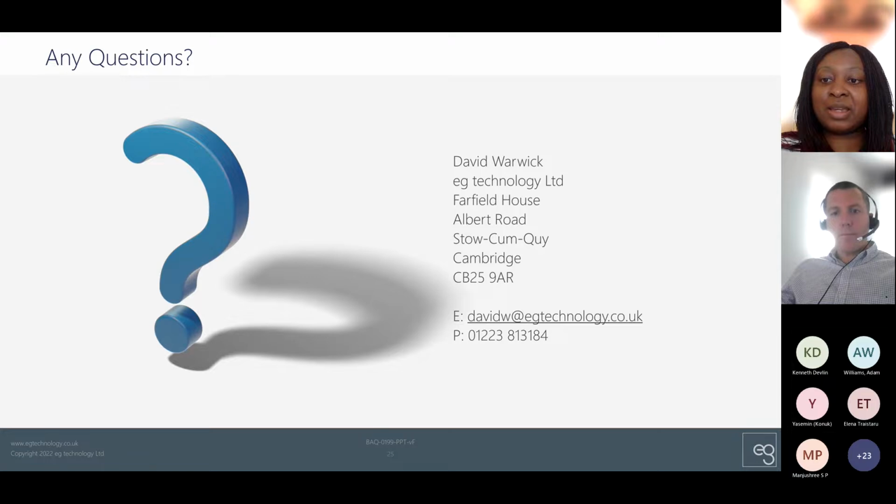Thank you. Next question: what type of AI and cybersecurity documentation is required as part of CE UKCA mark application? Oh, if only we knew. Right now, that is kind of the $1 million question. AI covers such a broad definition of things. It's really tricky. At the moment it's kind of baby steps. The only guidance we've really got at the moment is 62304 and following the processes in 62304.